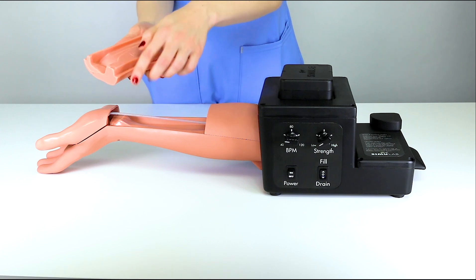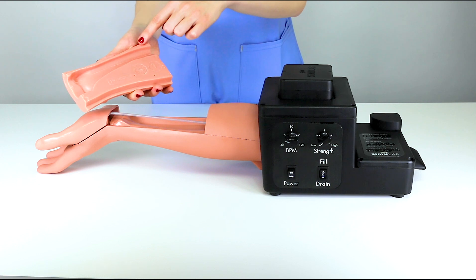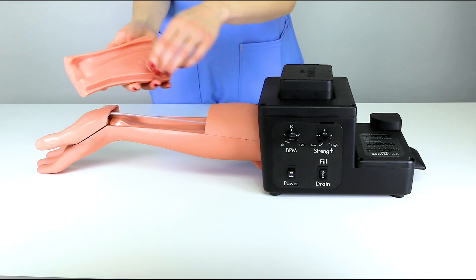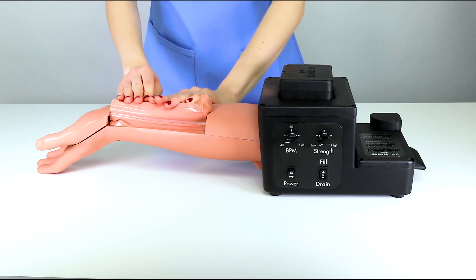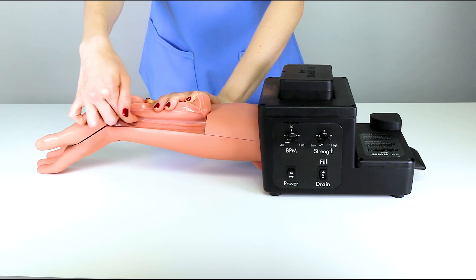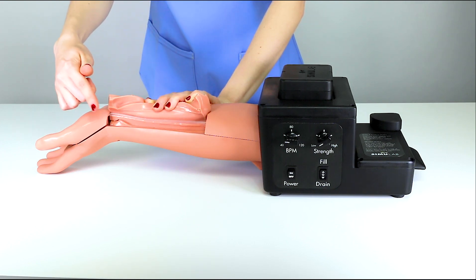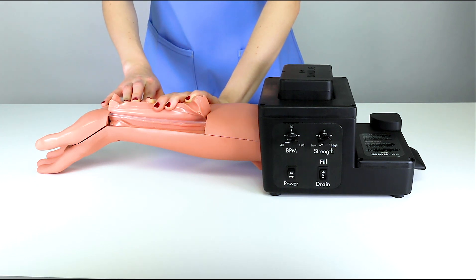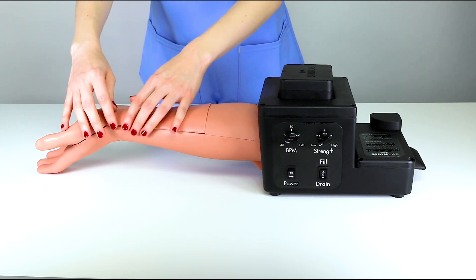You will also notice that the medial section of the tissue is larger than the lateral section. Place the medial section of the tissue into the tissue cradle first, keeping the lateral section lifted to view the artery. Tuck the artery completely into the channel along the length of the tissue. To maintain the integrity of the simulation, it is important that the artery stays in this channel while the trainer is in use. Then tuck the lateral portion of the tissue into the cradle, ensuring the artery stays in place.